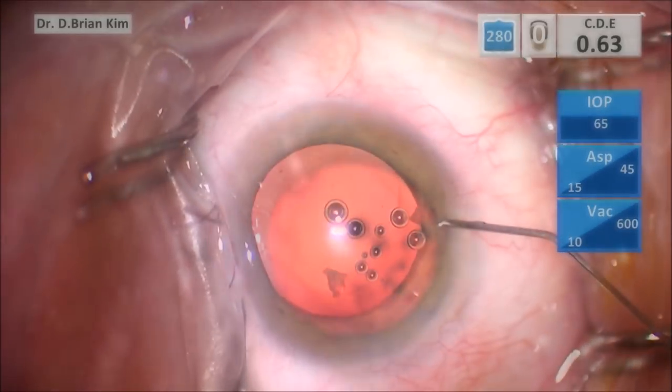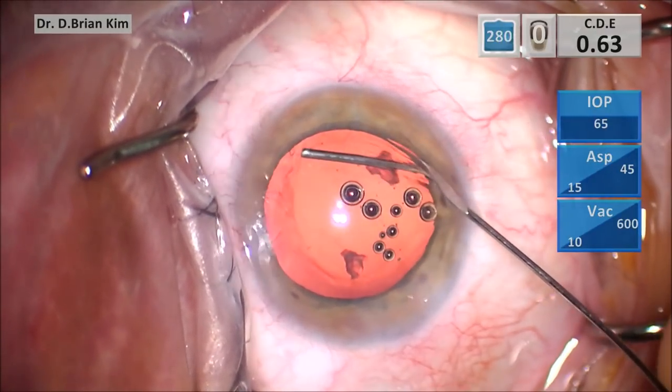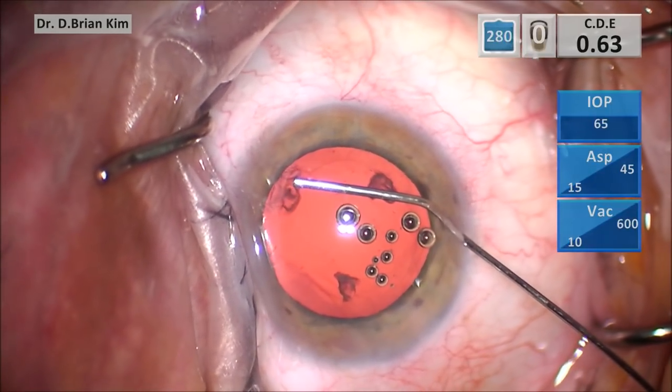As you can see, it's pretty large. So I don't really feel like I'm going to use that to optic capture a lens in the bag, because it's pretty big, but at least it's round and it won't radialize any further.